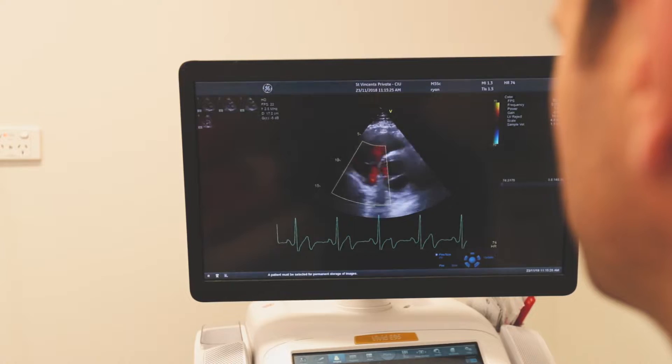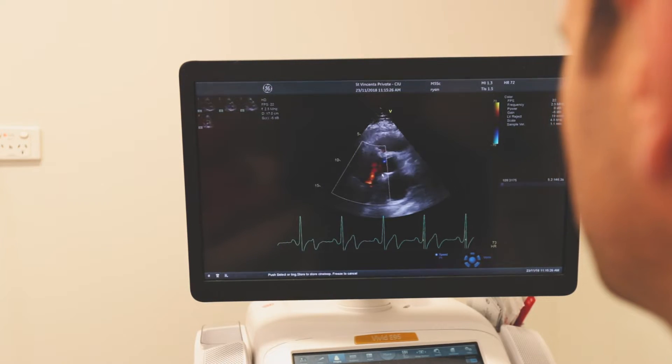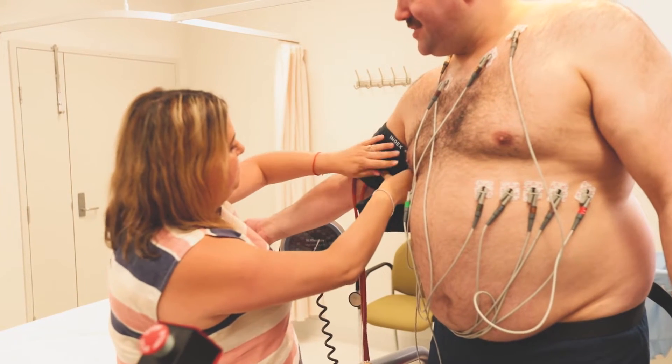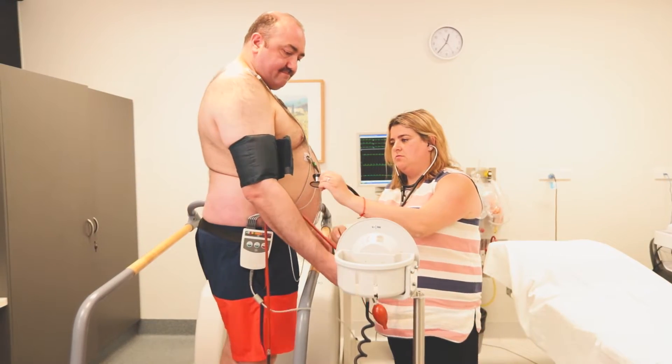While lying down, the sonographer will use an ultrasound to take resting images of your heart. The cardiologist will then come in to take your history and explain the test. Before the test begins, the cardiologist will take your resting blood pressure.